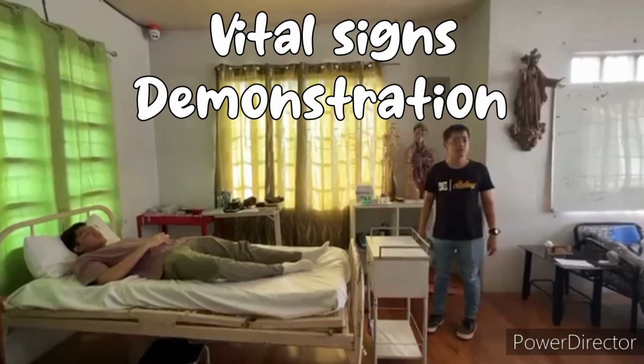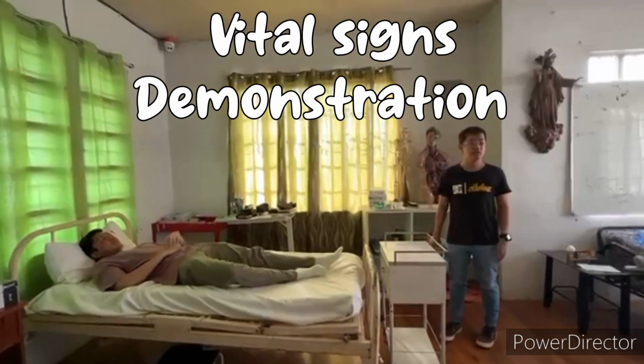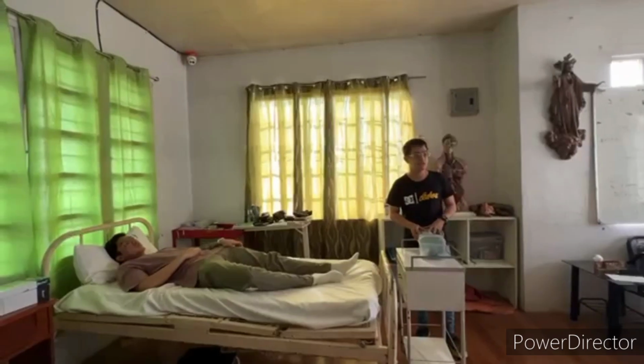Hi, good morning. My name is JR and today I'm going to be demonstrating how to assist a client in getting his or her vital signs. First and foremost, the first thing that you have to do is to make sure that your hands are clean to avoid spreading of the microorganisms and infection.